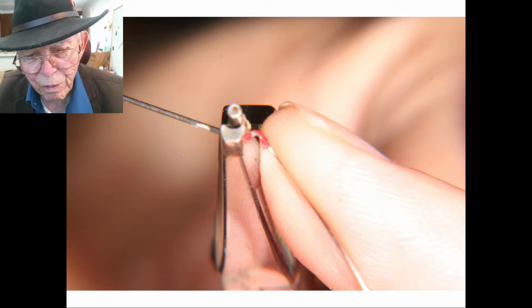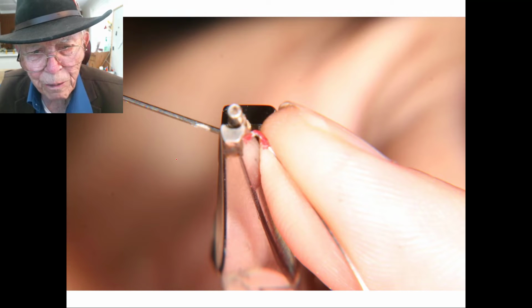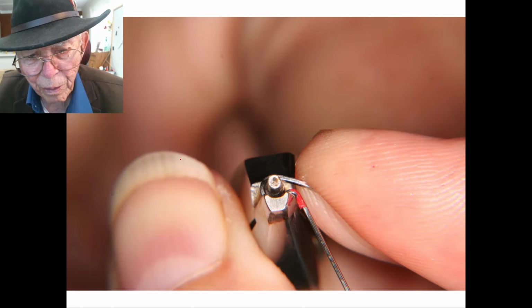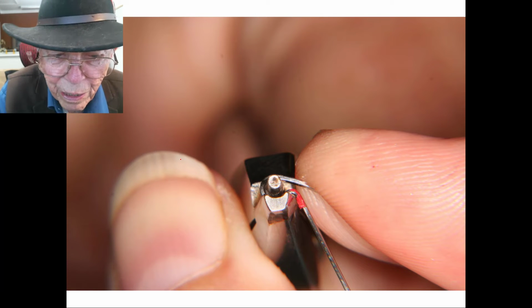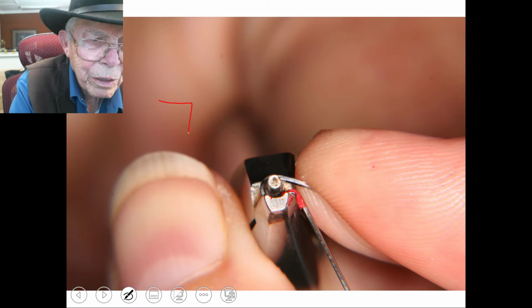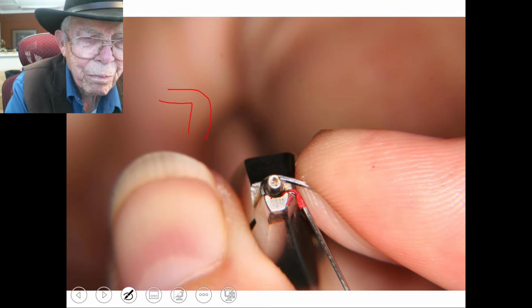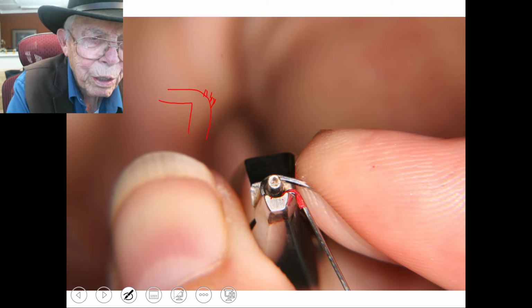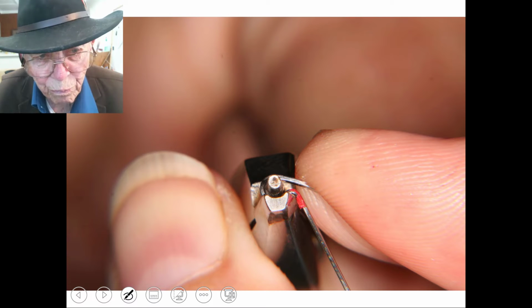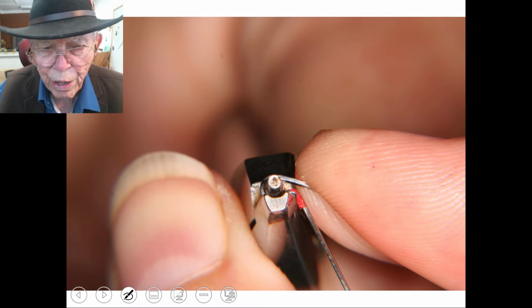Now I'm going to press that down hard. I've got a whole stack of pictures on this, so I'm going to move pretty fast, and we're going to wrap that around that second loop there. Now this plier is made so that when you bend the wire around it, you don't ever bend wire just 90 degrees. You kind of go like that, because you stretch the molecules up on the top part of the bend, and you squeeze this together down here. If you bend it sharp like this, the wire can break very easily right there where you stretch those molecules too much in that area. So you bend it around something that's fairly round as you go.